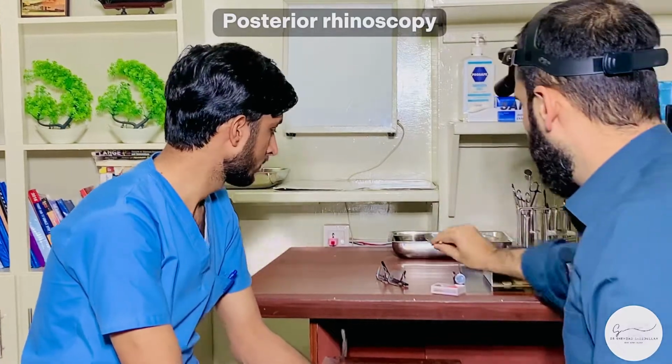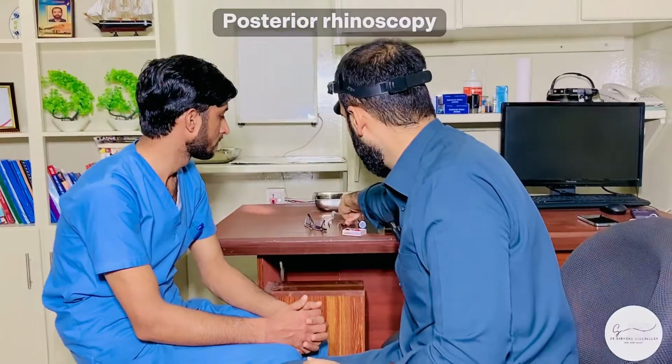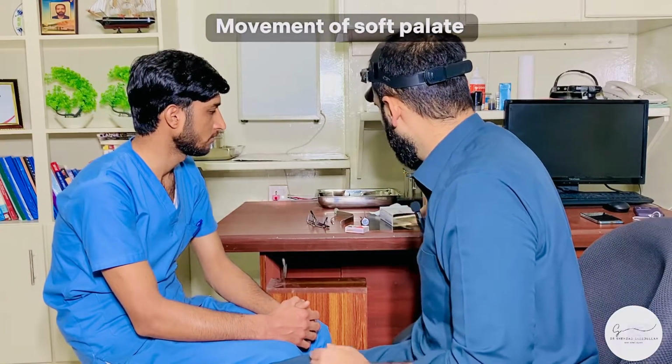One thing that you should be careful about is not to press the posterior pharyngeal wall, or else it is going to elicit gag. After doing the posterior rhinoscopy, the next step is we are going to look for the movements of the soft palate. So for that, you will take a metallic tongue depressor.